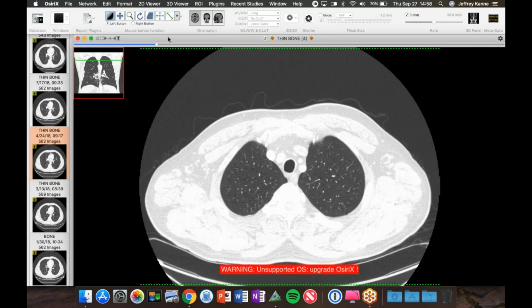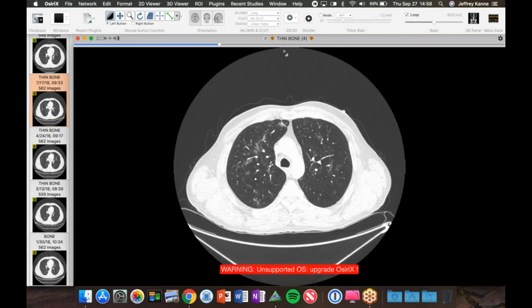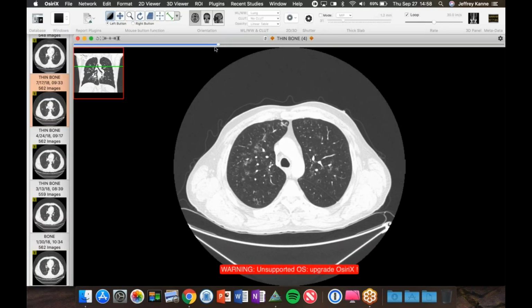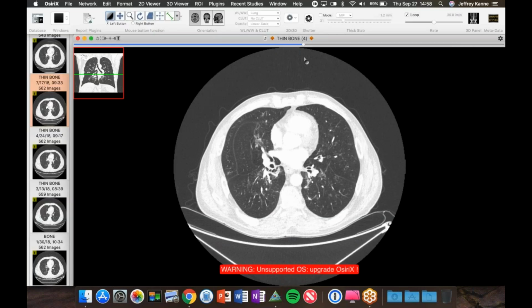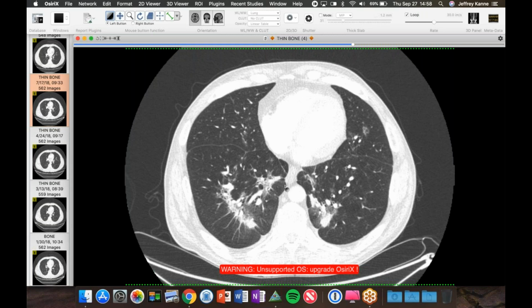Now, of course, head and neck patients will aspirate. They get infections. They get mets. So that's one possibility. It's a little fuzzy for a squame met, but not impossible. But at that point, the patient was presumably just doing okay elsewhere. And then this is 3 months, about 2.5 months later, where you really get this peribronchial area of ground glass consolidation. Looks very much inflammatory around the airways. You might think aspiration. And then you can see this radiation fibrosis is continuing, or injury in that area.